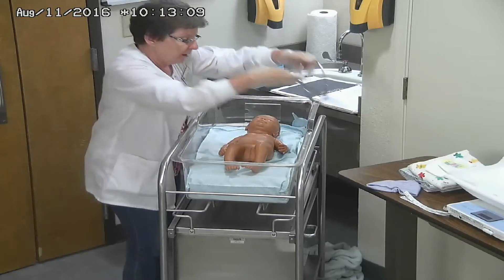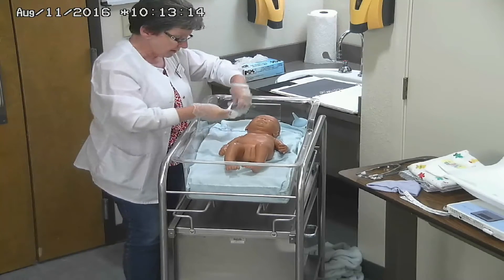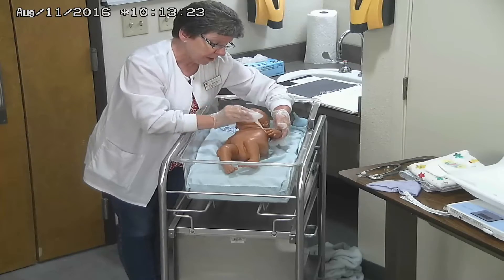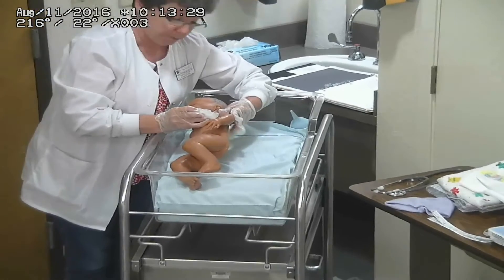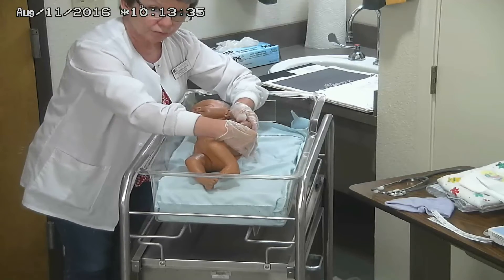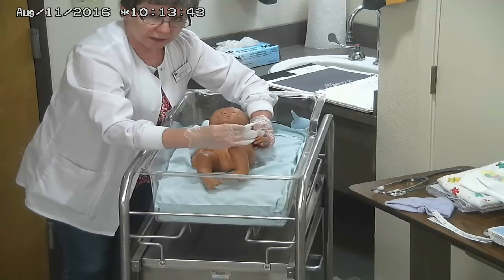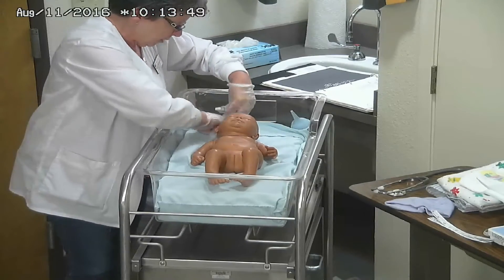Then I'm going to get a temperature. One thing that happens to newborns is they become what we call cold stress. I'm going to demonstrate: instead of putting the thermometer this way — which risks flipping the tip through the back of the arm — you hold the arm up and put the probe of the thermometer directly in the axillary area. Wait till it beeps, get a temperature, and document that.